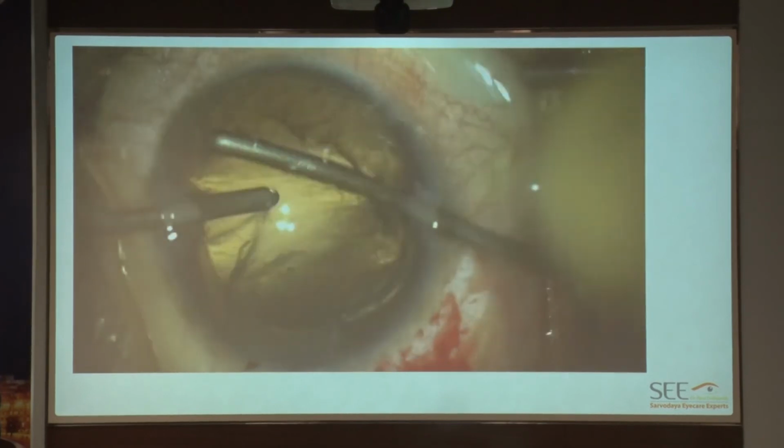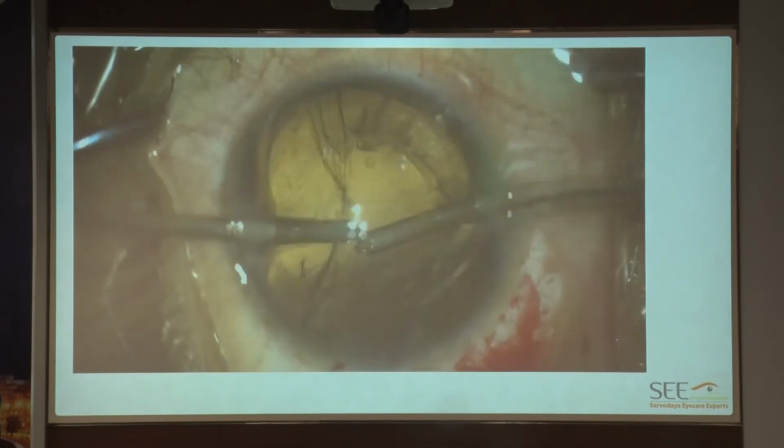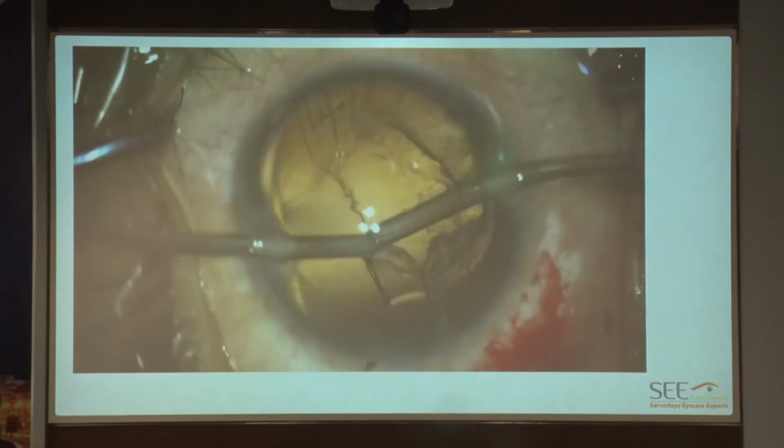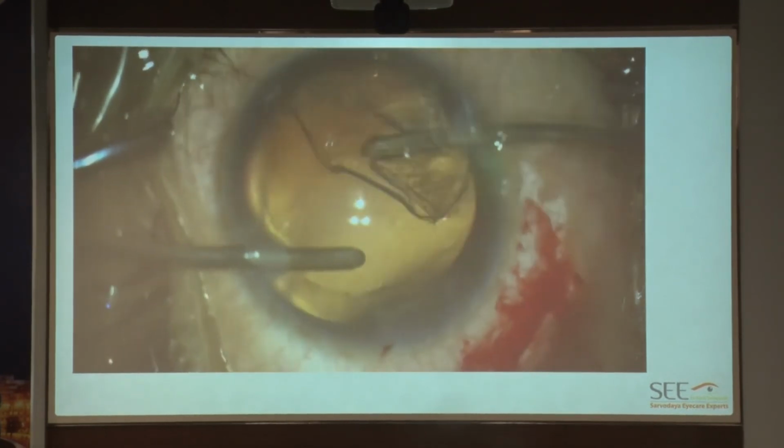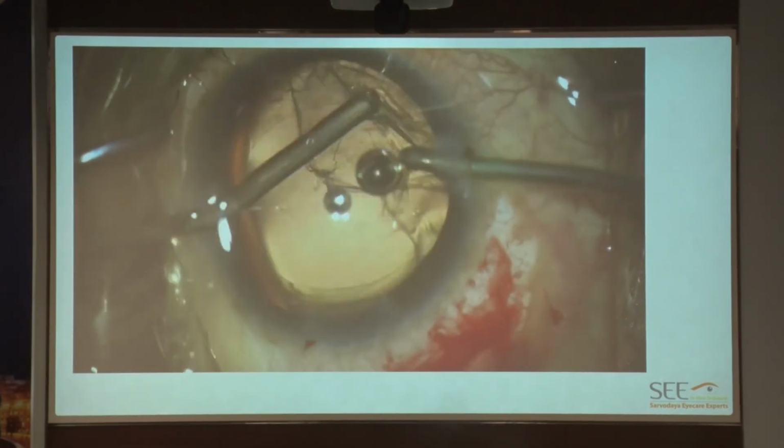While doing a cortex wash, you should not use centripetal force in the area of zonular dialysis. It's usually preferred to use a tangential or lateral force to remove the cortex.